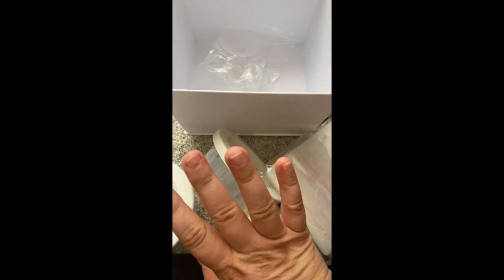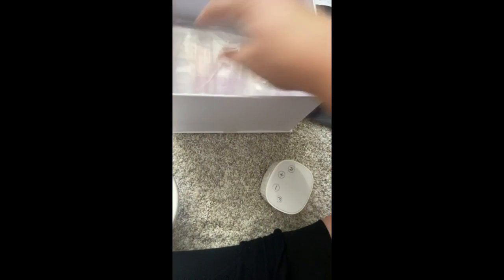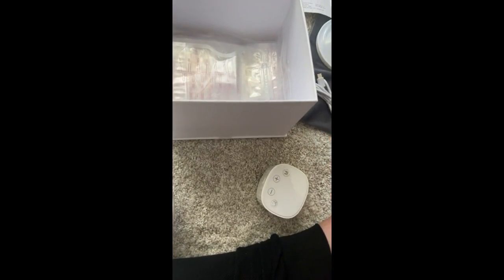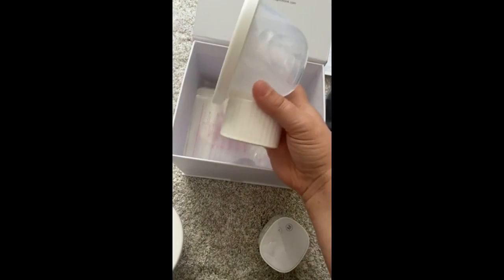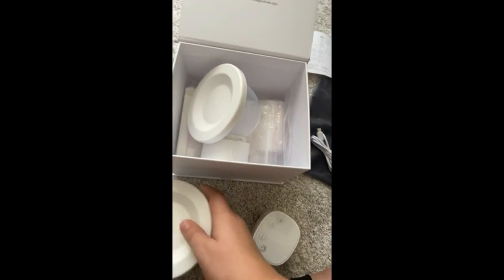I have the 19s already in here because I am a 19. It's crazy because before I used to pump with a 24 and I wasn't getting a lot of milk out. And so I actually resized both nipples because each nipple can be a different size. Like one can be a 19, the other one can be a 22. Every mom is different. So definitely take into account, the most important out of these is the flange fitting, I think.